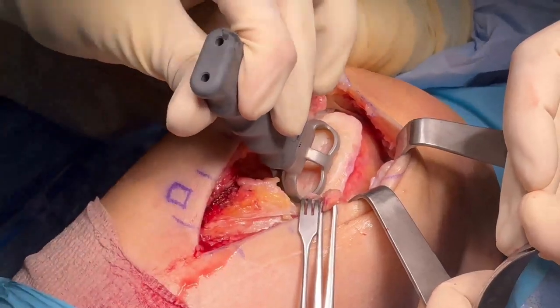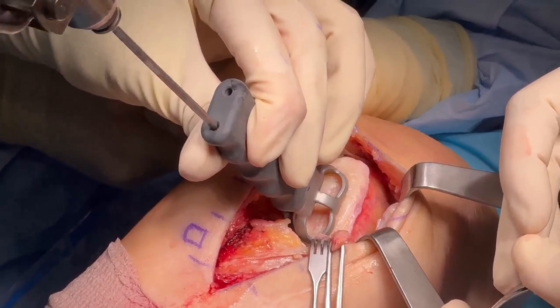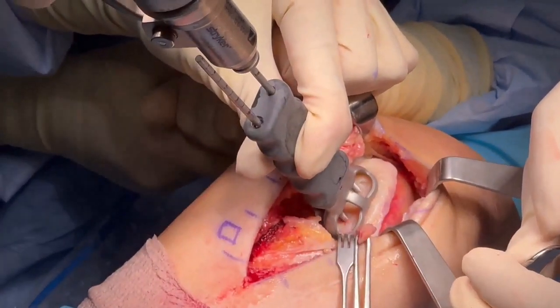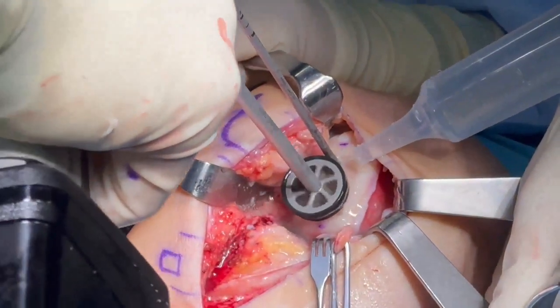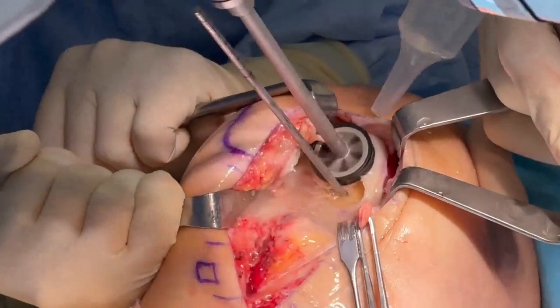These steps were repeated on the medial femoral condyle for femoral implantation. However, given the large area of the defect, we decided to use an oblong implant. To begin, the femoral oblong pin guide was placed over the defect and the guide pins were driven into the superior and inferior holes in the guide. Next, the femoral central reamer was placed over each pin to ream until proper depth was achieved via the hard stop at the base of the reamer.